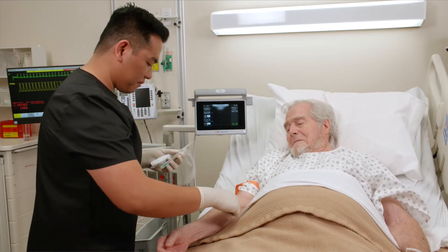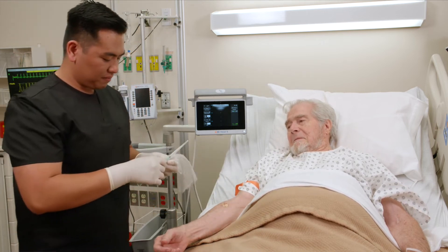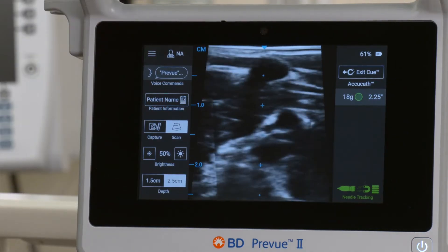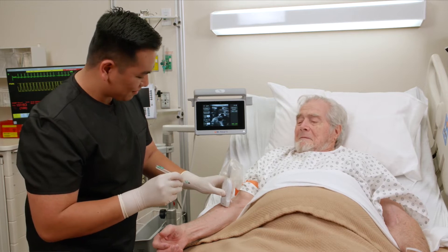Perform the vessel assessment and preparation for device insertion per hospital policy. Position the probe on the patient's arm, aligning the vessel to the center markings of the ultrasound display.